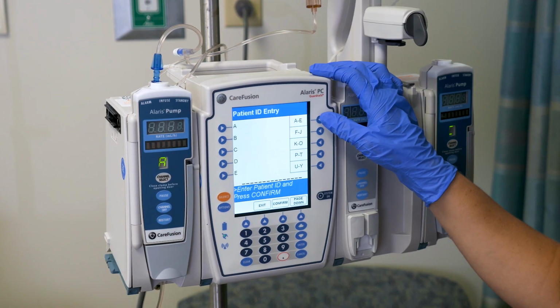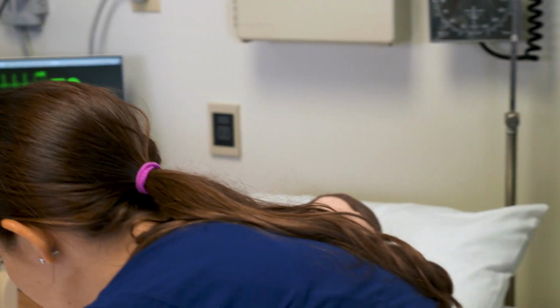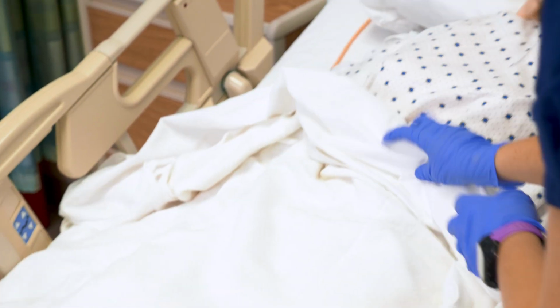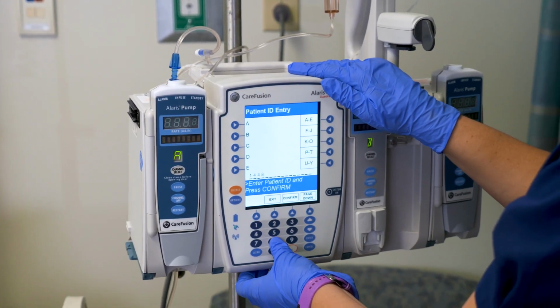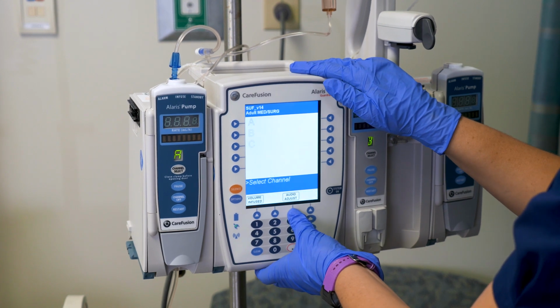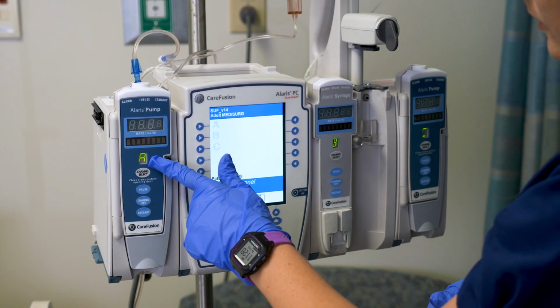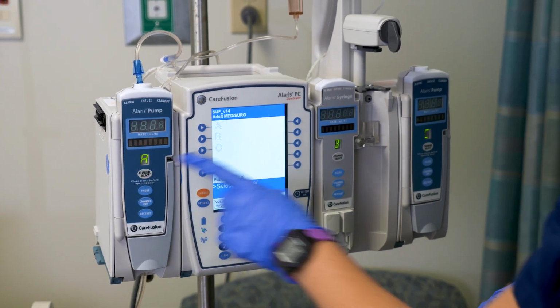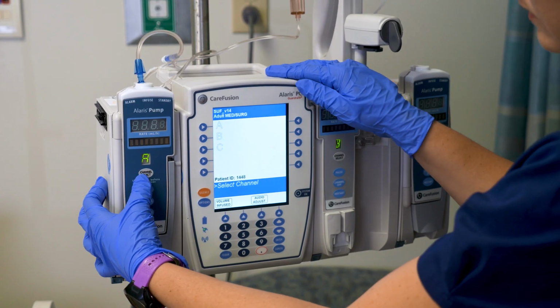Her ID number, I can either check my chart or we can check her band here real quick. I'm going to confirm. And then my infusion is going through channel A. You can see this one says A, this one says B, and this one says C. So we are on channel A.